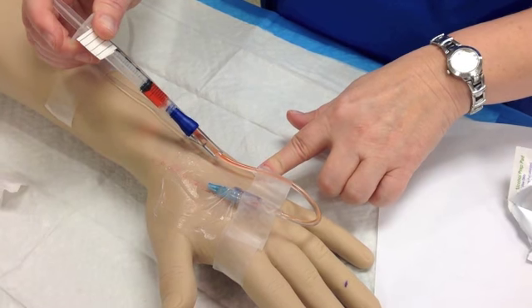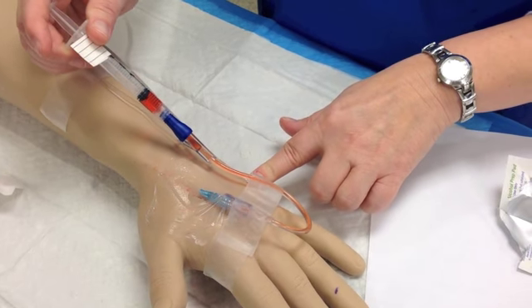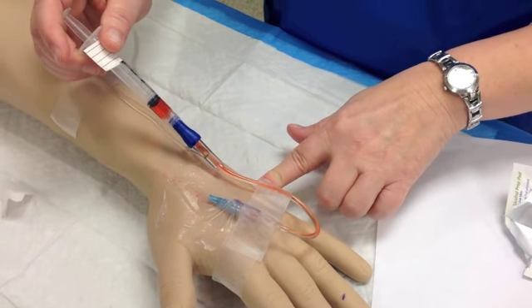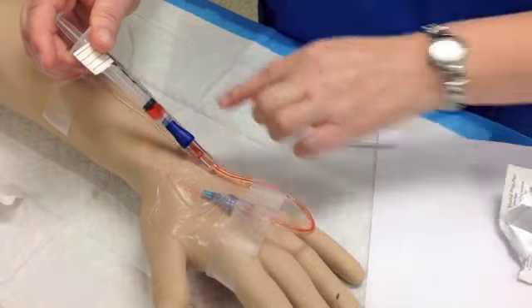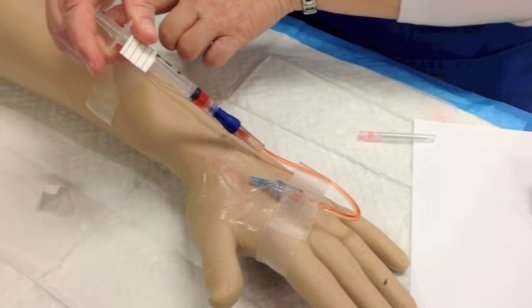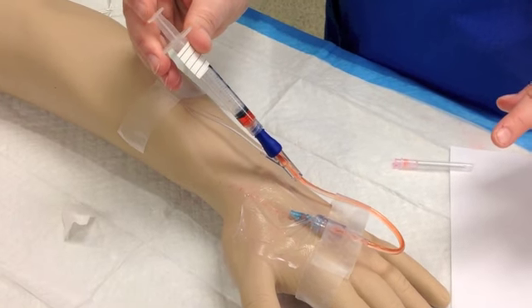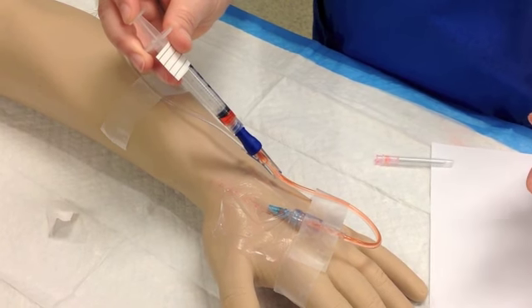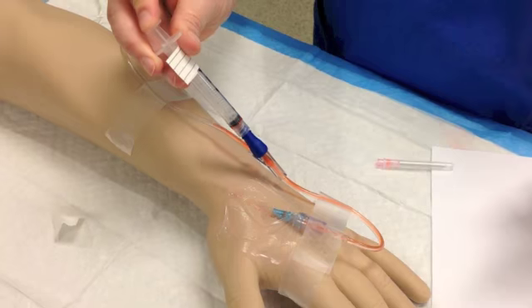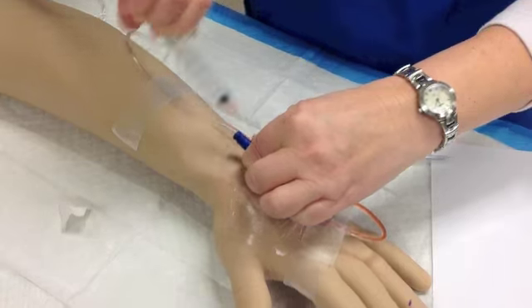0.1 again. Wait. 0.1 again. Wait. And notice the medicine's clearing. It's still not coming back up in my tubing. So just keep pushing 0.1 and waiting your 12 seconds. And then when you're finished, your IV should flush it completely because this one's running.